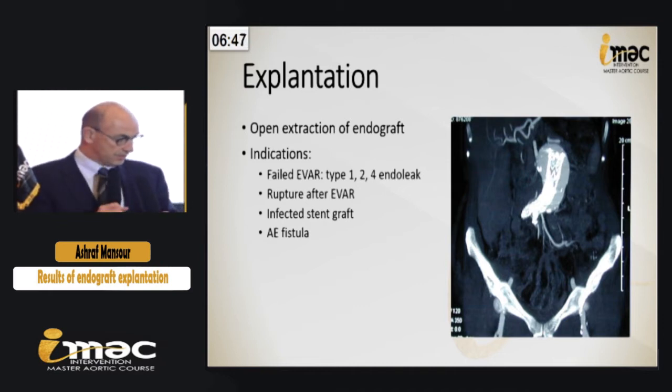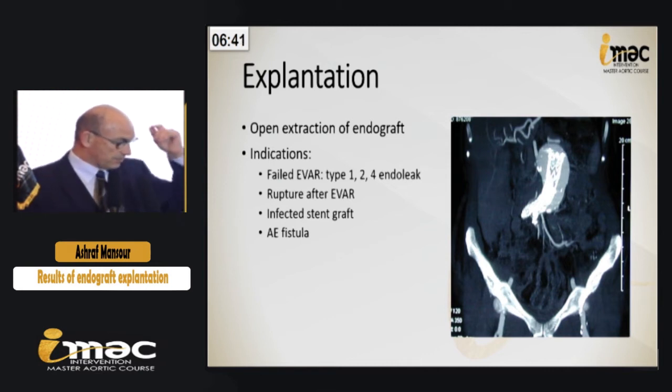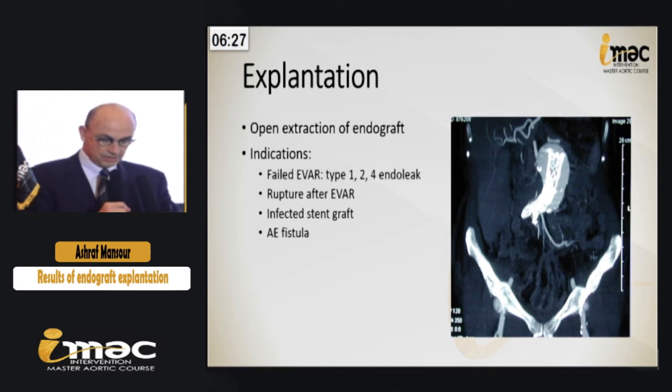My discussion is really following very nicely the first two speakers today in terms of why do we need to do explantation, the indications, what are the results of the explantations, and what are the implications for our teaching institutions in terms of teaching our registrars and residents and fellows how to do these cases. Briefly, the indications, as you heard, were a failed EVAR, or a rupture after EVAR, which I'll discuss a little bit later in this session, or an infected stent graft, or some kind of aortoenteric fistula.